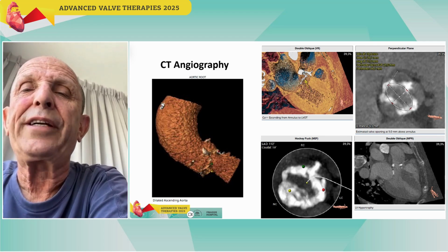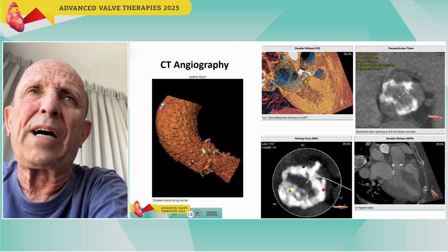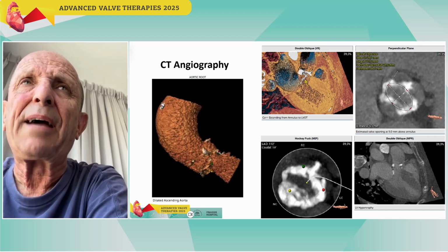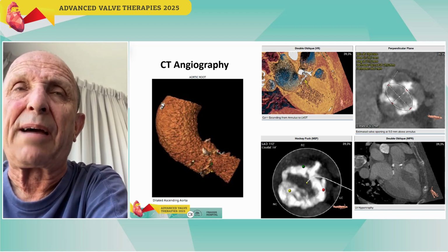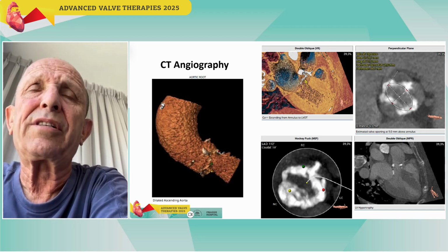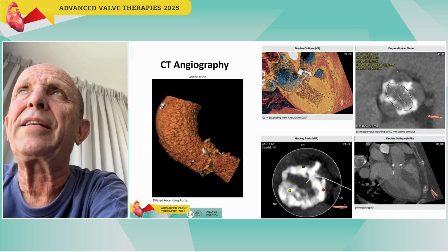So this theory or best practice of choosing the balloon according to the smaller diameter is too conservative, and this is really history. We're using a bigger balloon now, nothing happens with it, and if something happens, it's not because of the diameter, it's because of the calcium at the LVOT. This is the only thing that you should be concerned of. These are the only cases that have annular rupture or something. Otherwise, choose the balloon according to the mean diameter.